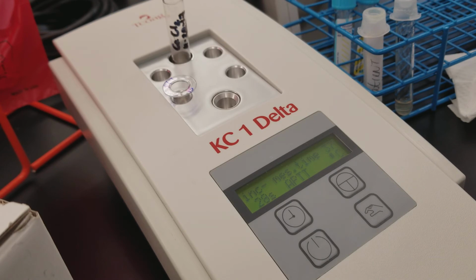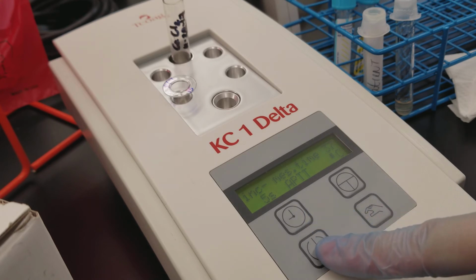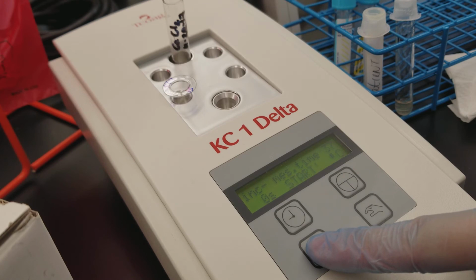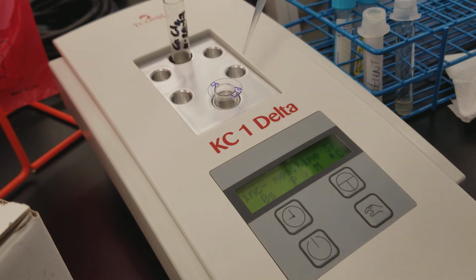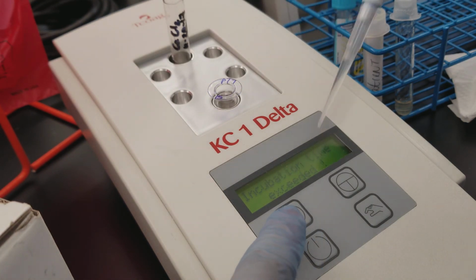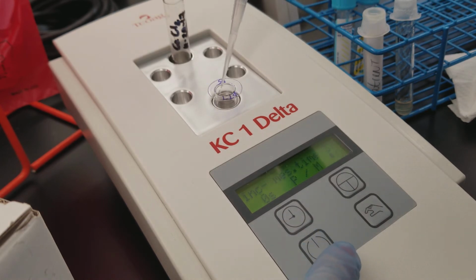All right, so we're at 30. I'll come back when it gets closer. Okay, it already started beeping at me. The important part is when we get to zero, we press, sorry, not the clock face, the power button. Okay, so we're putting it into the measurement well. I forgot to press this part. That's okay, we just press this again. We add the calcium chloride and we press the hand.